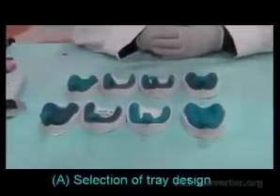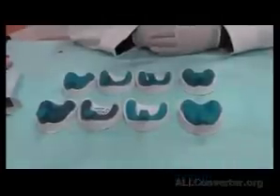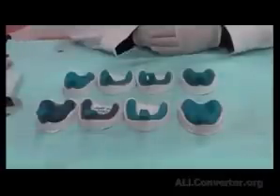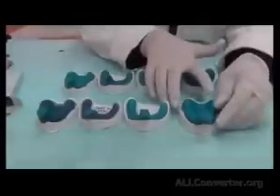Today we will be doing a demo demonstrating the procedure at clinic number 2. Just to recap on what we have done, in clinic number 1 we have finished the examination of the patient, and then we have made primary impressions. In lab number 1 we have asked the technician to pour those primary impressions and fabricate a primary cast. Then we asked the technician to make for us a special tray over that cast. Then the technician, once he finishes his work, will deliver it to your clinic. So what you'll have in your clinic are the following options.